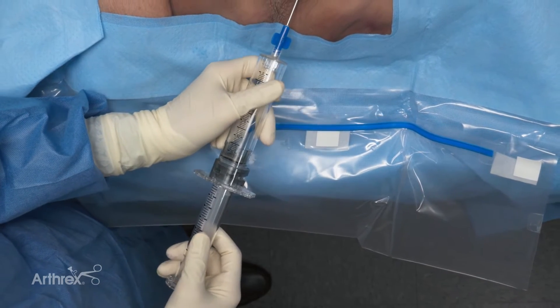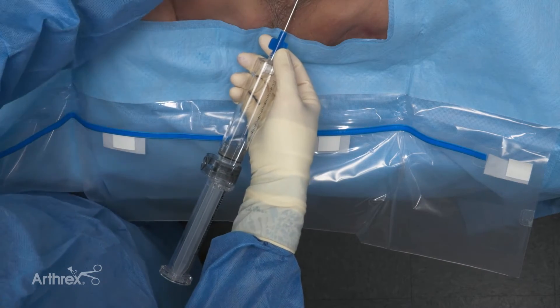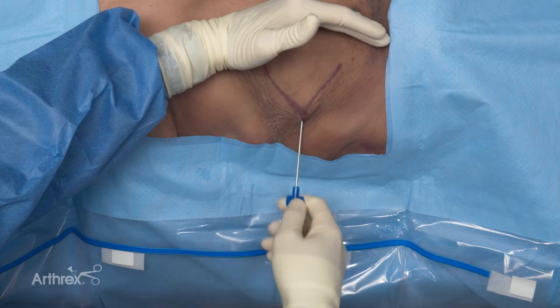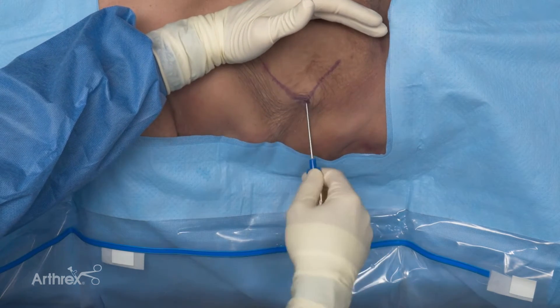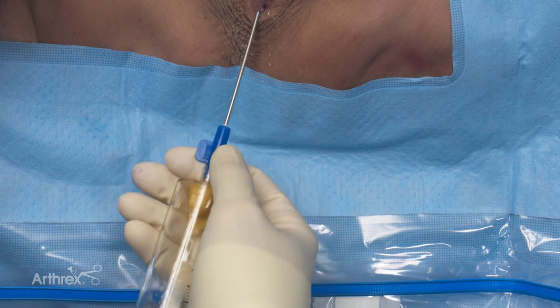I'm going to retract it until the device locks. Once it's locked in place, that's created our vacuum seal. We're performing our harvest here with the exact same movement patterns — just that wedge-like pattern in the horizontal plane, making sure I'm guiding with my free hand. And you can already see the adipose is starting to be pulled into the restore syringe.